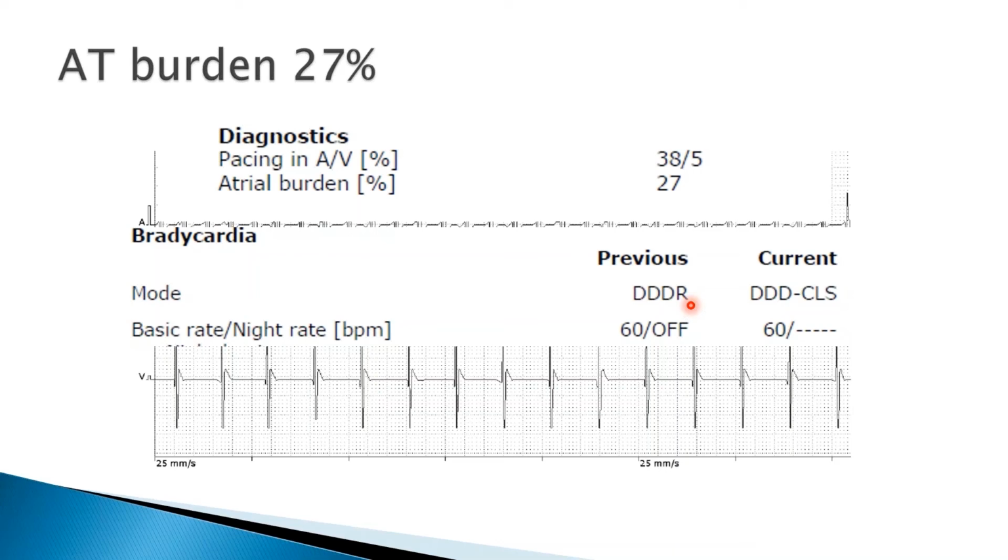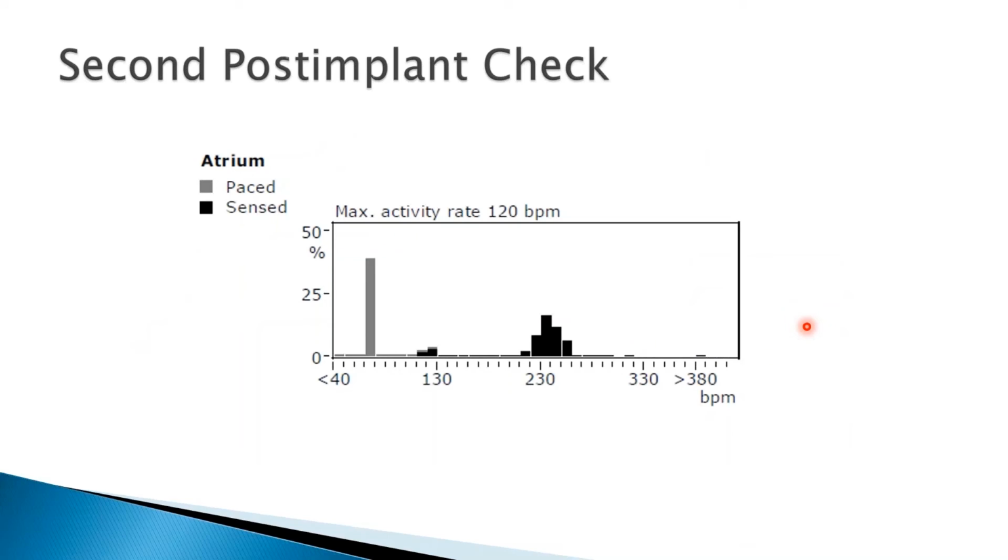So we decided, since this patient had a CLS capable pacemaker, why don't we turn on the CLS algorithm? And true enough, we turned on the CLS algorithm. So the rate responsiveness of the pacemaker now relies on closed loop stimulation, no longer the cruder, more native form of open loop stimulation. Then we checked the patient back in 6 weeks' time.